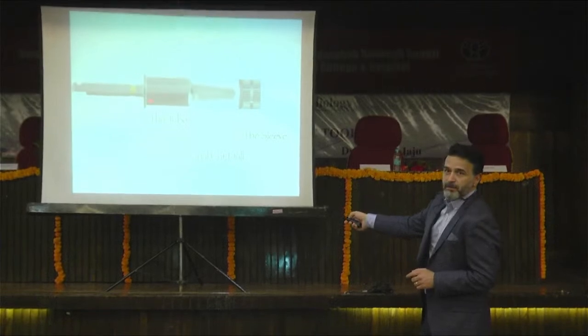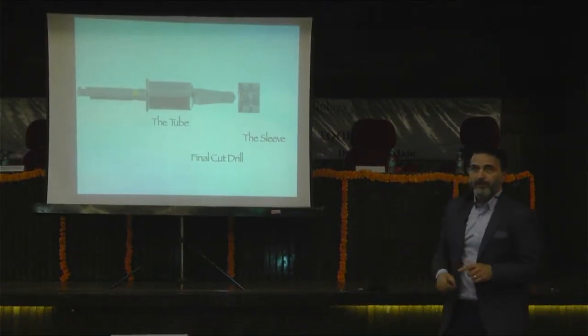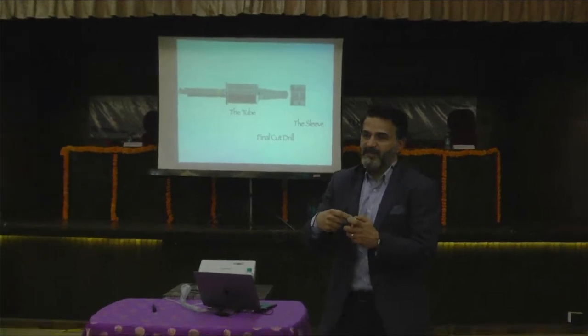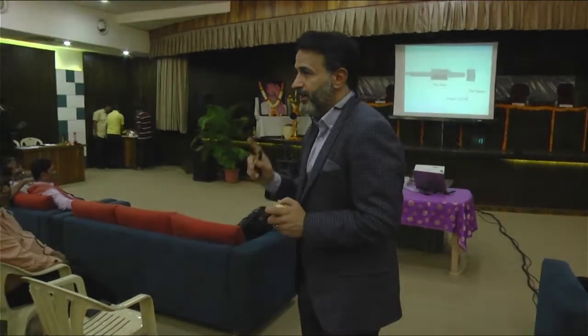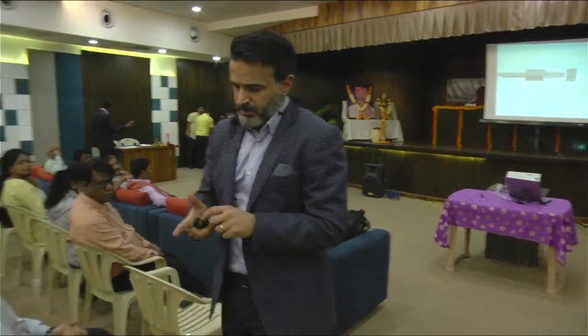This part, the same. The final cut part differs from drill to drill. So when passing through this sleeve, everything is the same. A unique procedure, similar procedure. Got it? Perfect. Okay.